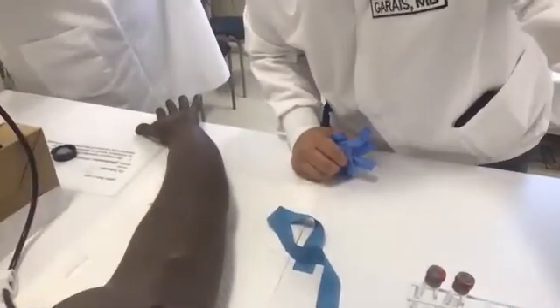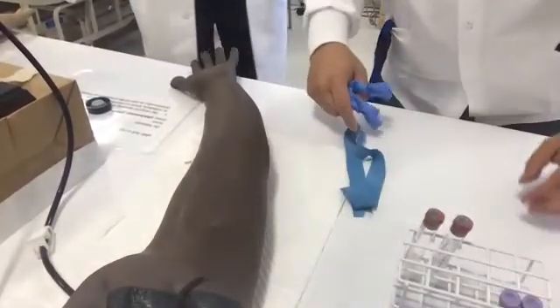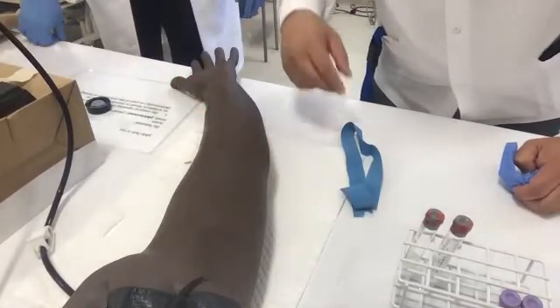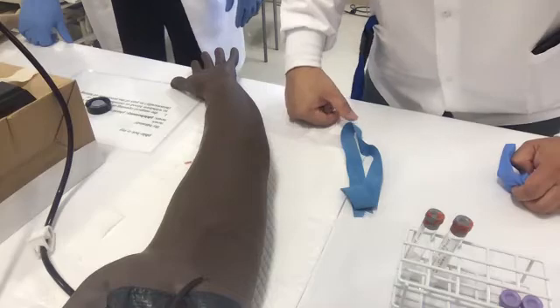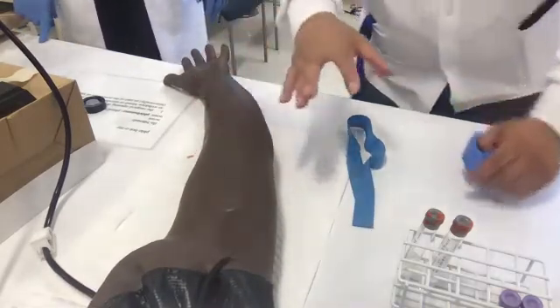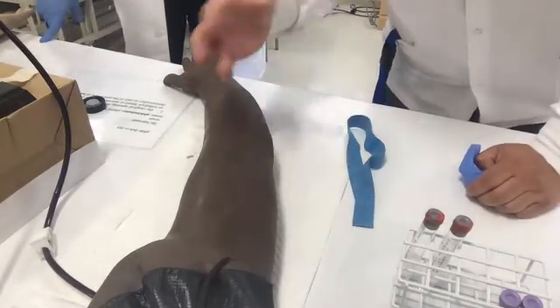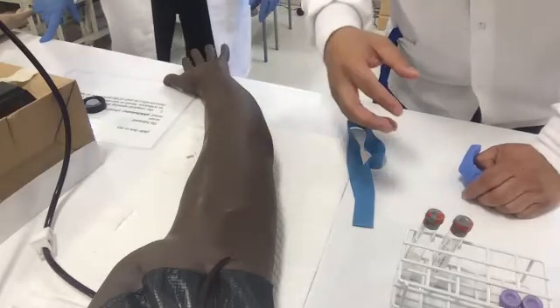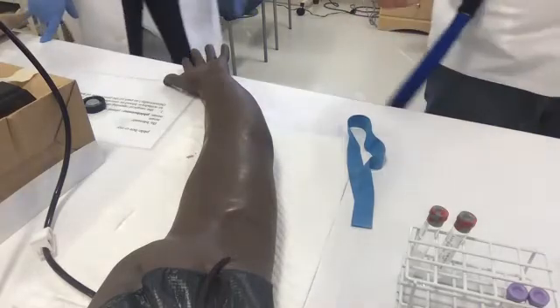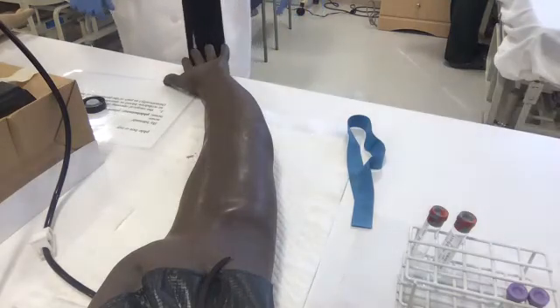Hello. And this is phlebotomy. And you could see, I'm going to set up the equipment here. Okay, and then I'm going to do a demo from beginning to end. Then you could be good and you can log off. Okay, so at least I know this is, of course, being recorded, and I'll keep this so you can look at the protocol and compare it to the protocol that's in your Moodle. Right. Okay. So of course I always got to glove up and I always got to wash up. So let's pretend I did that. Okay.